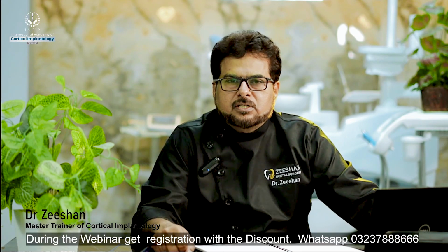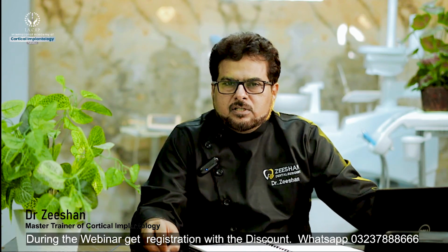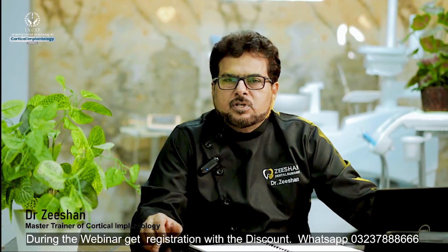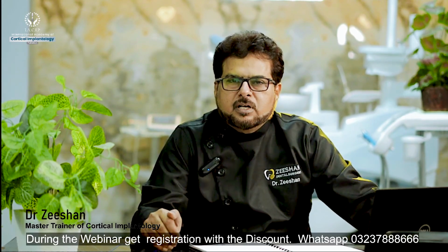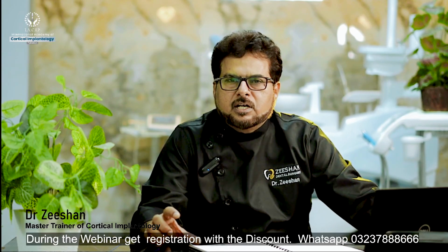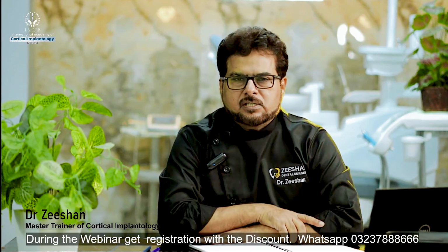This is the basic difference between conventional and basal implantology: conventional implants are placed in the spongy bone or cancellous bone, which is more prone to resorption, and after teeth loss the bone is resorbed and we have very little bone to place the conventional implant. We need at least 8 to 10 mm depth to place the conventionals, and then we have to wait.